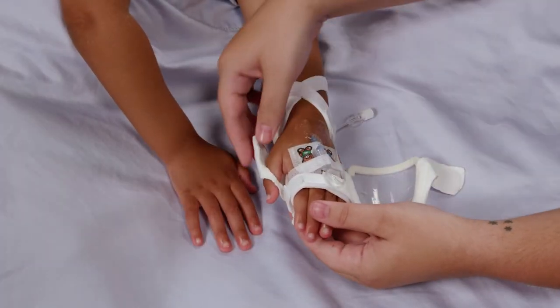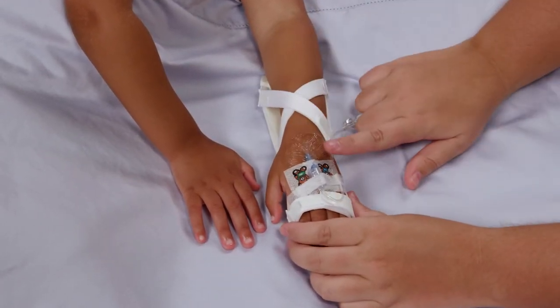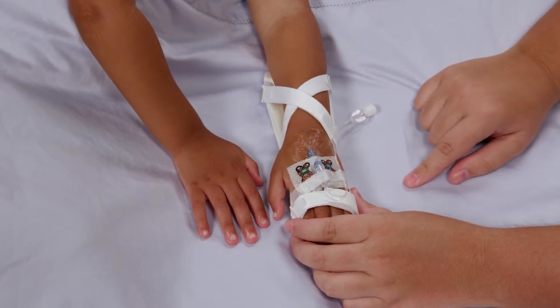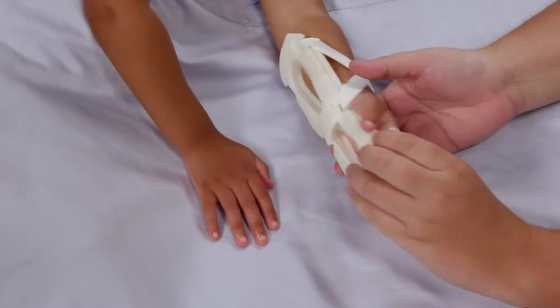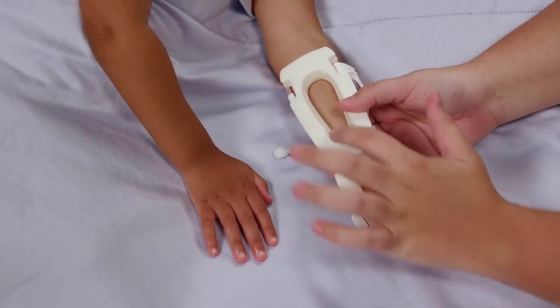Tell the patient that the puppy likes to sleep on the house and to leave her alone. Release the Velcro tab to inspect the IV site according to your nursing practice guidelines. Check the IV insertion site according to your hospital's policies and procedures. Turn the extremity over to touch, look, and compare the IV site with the opposite extremity.